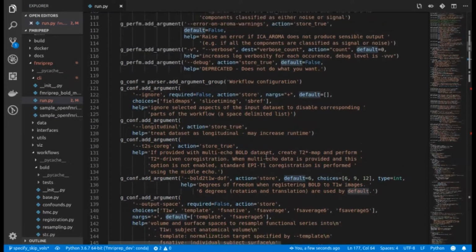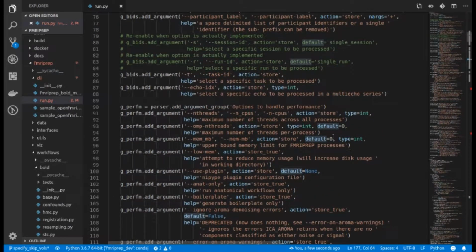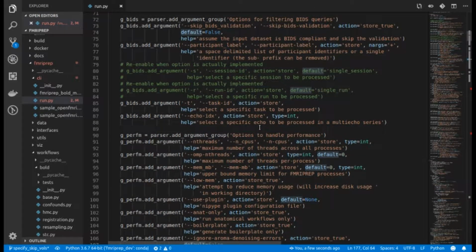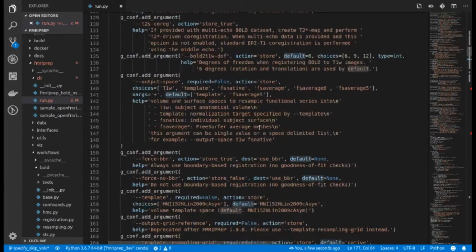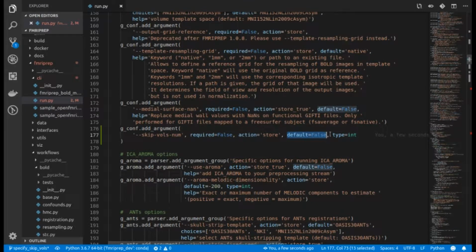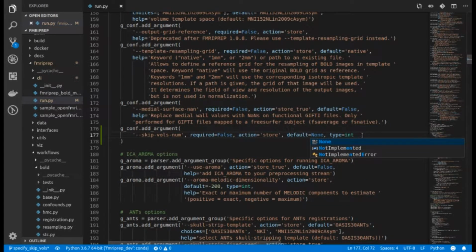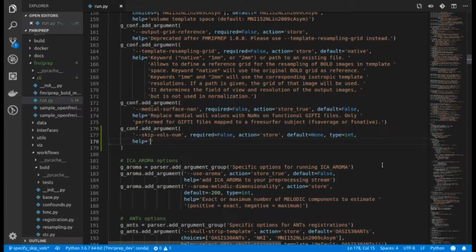Be multiple. Okay. That might be problematic. If I don't specify a default, what's maybe the worst that happens? It'll be None. None. If that doesn't hurt us.